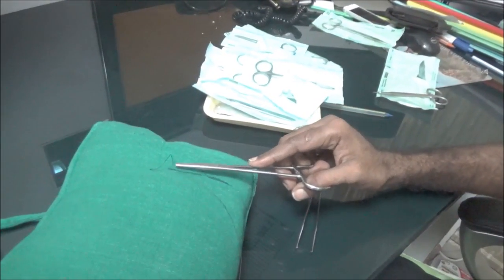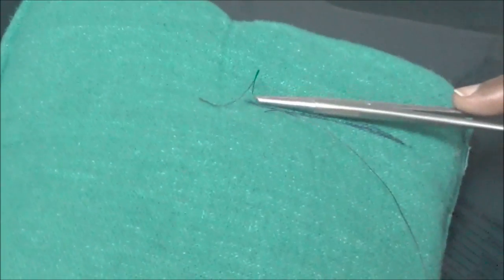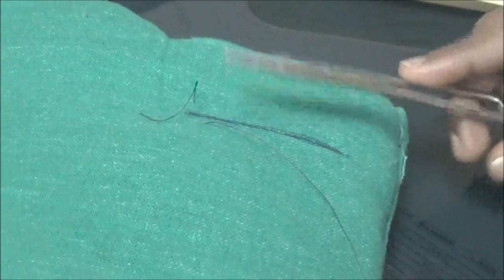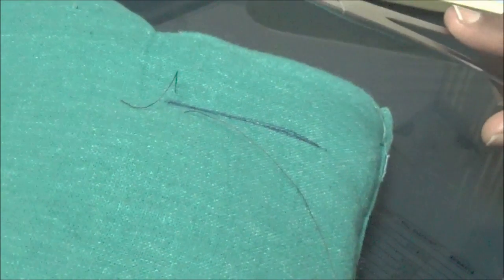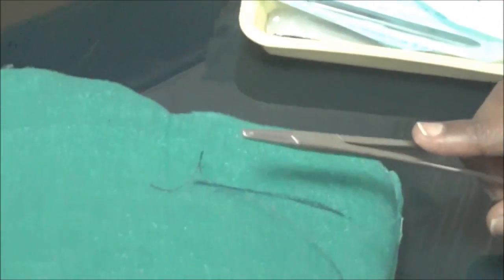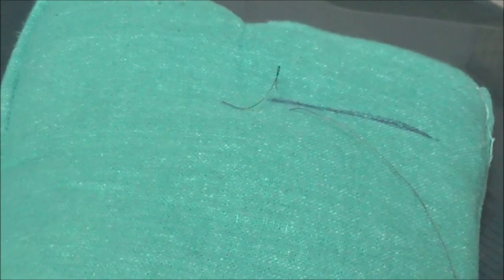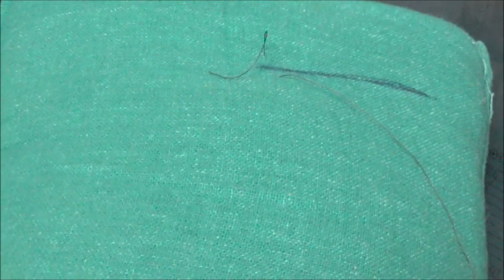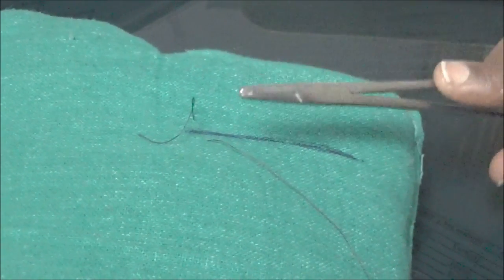This is called the rule of three. The needle entry should be approximately 3mm from the wound margin — not too far and not too close, otherwise you may tear the tissue. Also, when placing the next suture, maintain at least 3mm distance from the first suture. It can be 5mm — that's fine — but don't place sutures too close together as it will disturb the blood supply.